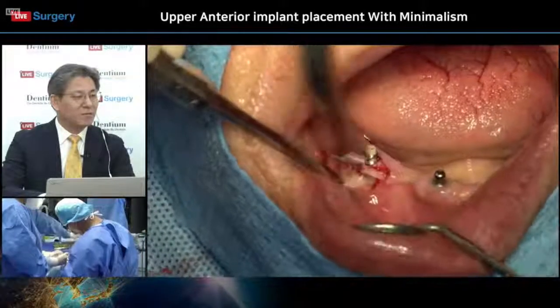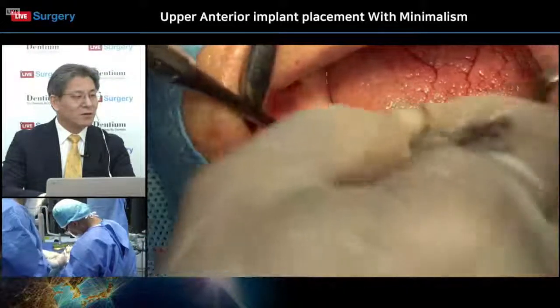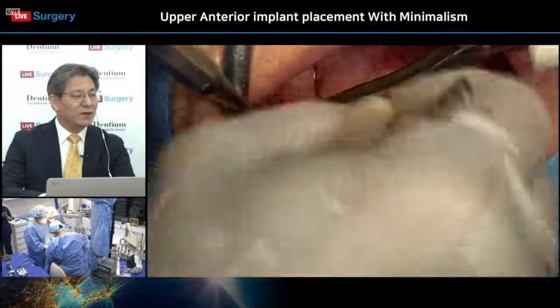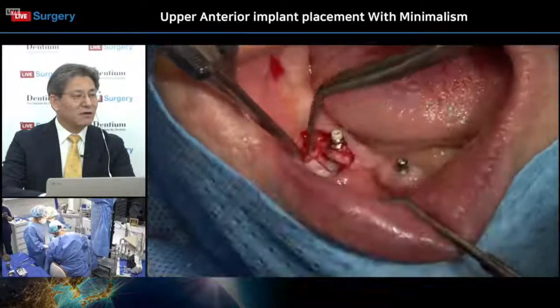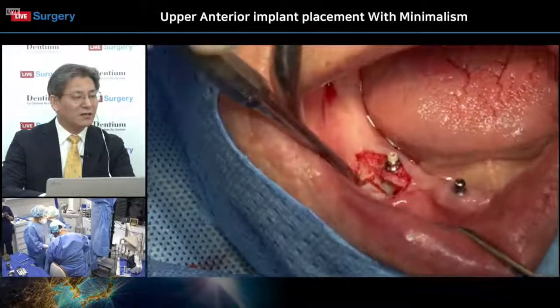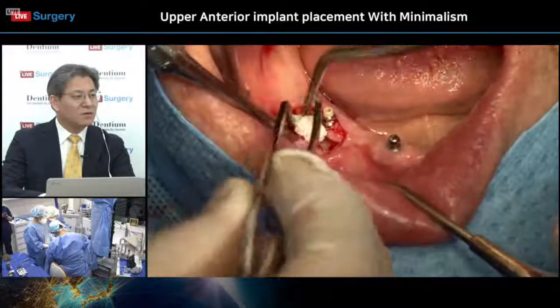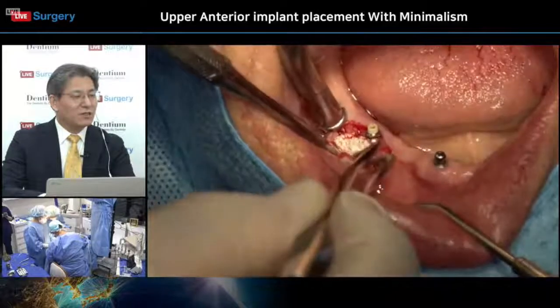So, first place the collagen graft. Yeah, collagen graft first, as a barrier. Yeah, it is not a membrane, but working as a barrier. So, and then the Osteon3 collagen.